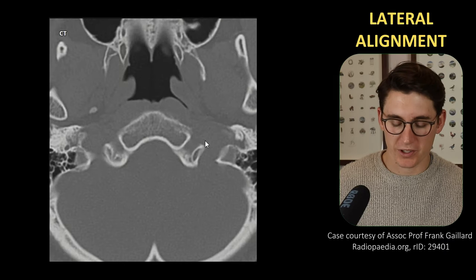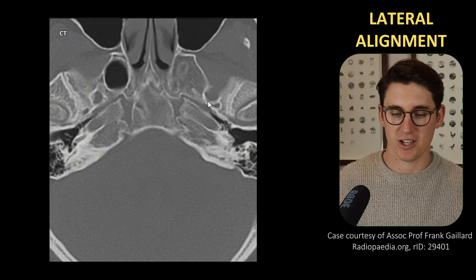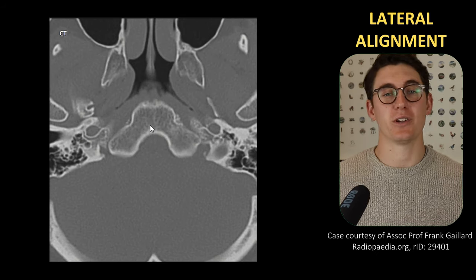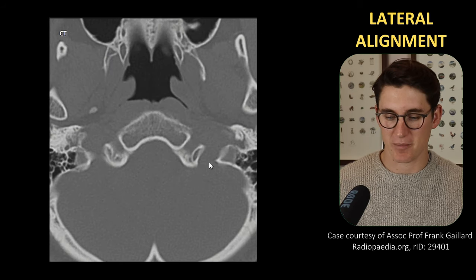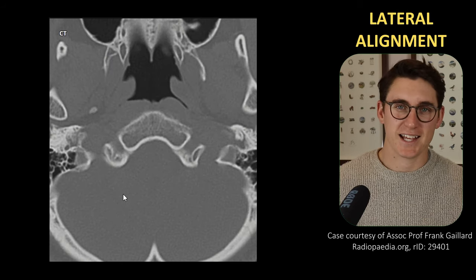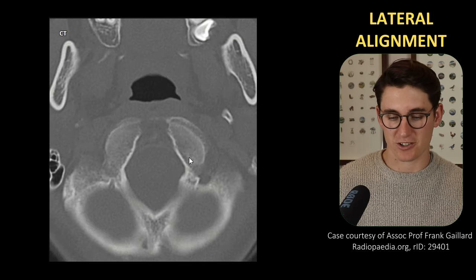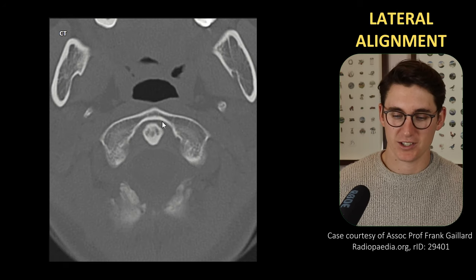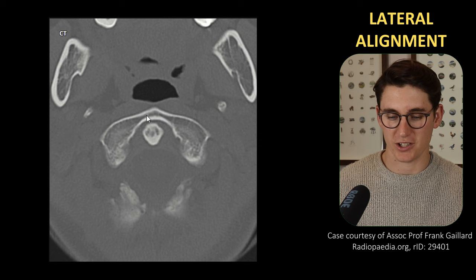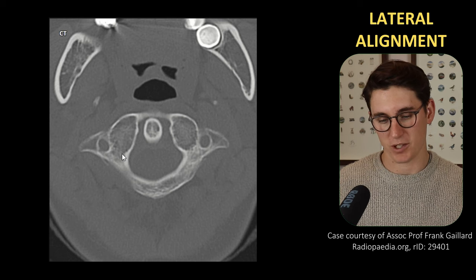Here we have an axial bone-windowed CT. We're going to head up into the skull base first. This is an image you should be familiar with if you've watched the skull base foramina videos — you should be comfortable naming these various foramina. As we head down towards our occipital bone, we should find our occipital condyles that articulate with our atlas, our C1. Here is the anterior body of our C1, the anterior arch, and as we head down inferiorly, our posterior arch of C1.